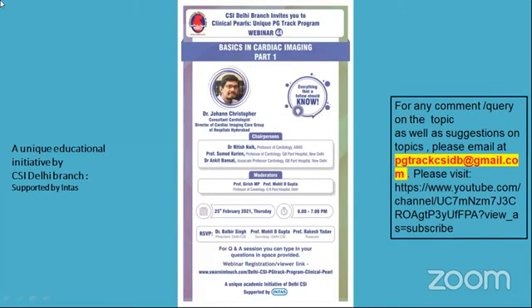So in the same patient, if I get an extremely low T1, that would be more of Fabry's disease. And if the T1s are elevated, it's the classical hypertrophic cardiomyopathy. So that's how it really helps us. And the ECV in Fabry's disease again is low.